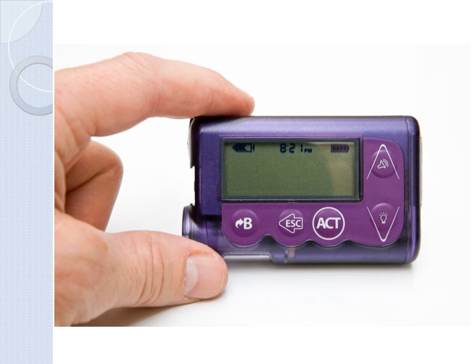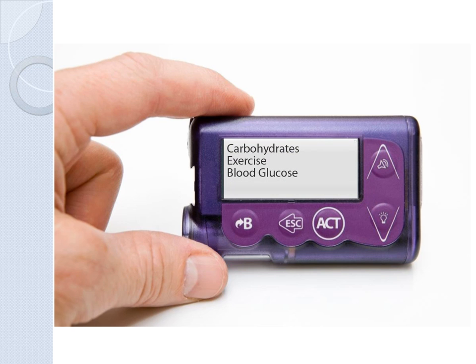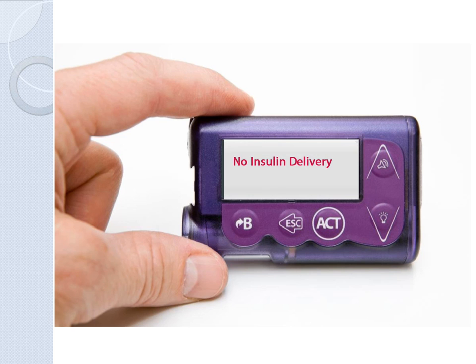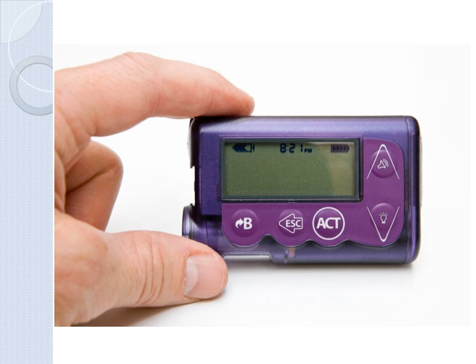An insulin pump is a small device about the size of a pager, which contains rapid insulin only, that meters out small amounts of insulin to mimic a basal rate. The patient then tells the pump how many carbs, how much exercise, and what their present glucose is, and along with the pump helps calculate small boluses of insulin. The pumps are quite sophisticated in that they can alarm, for instance, when insulin is not delivered. Controls can be set so that large amounts of insulin are not delivered accidentally.